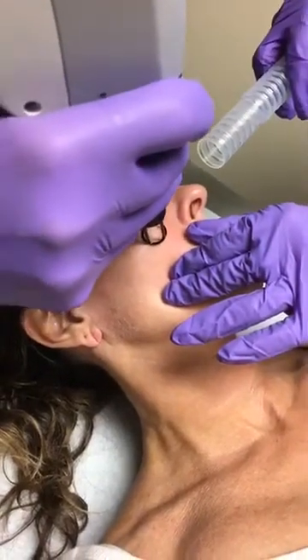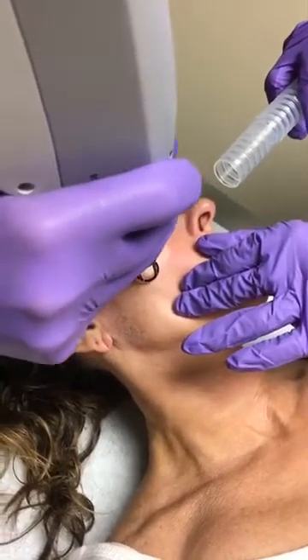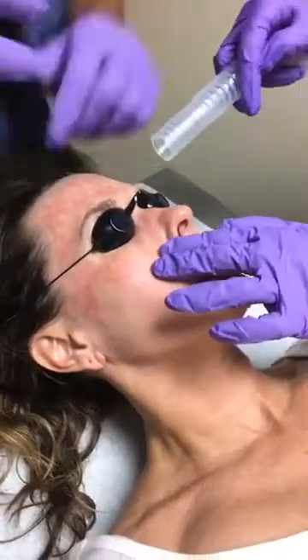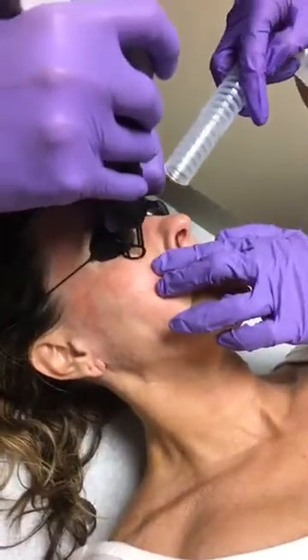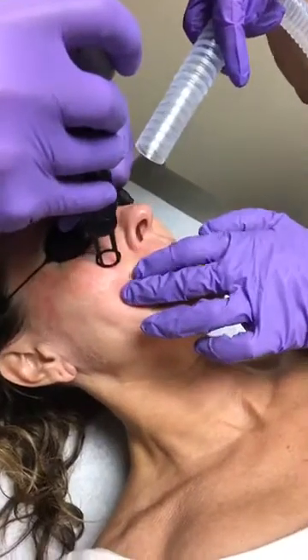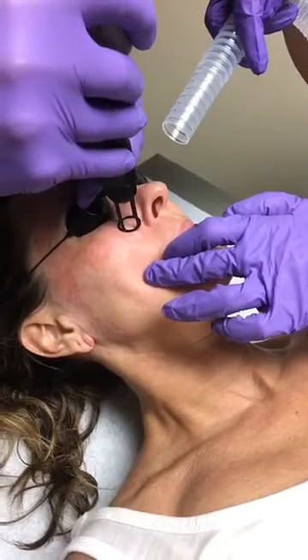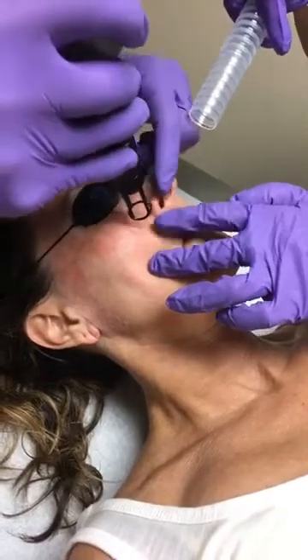We're really excited about the platform in this laser as well because it is a multimodal platform. So in addition to what we can do in terms of resurfacing here with the Erbium, we can use the Yag to deal with veins both on the face and those little spider veins you get down on your legs.